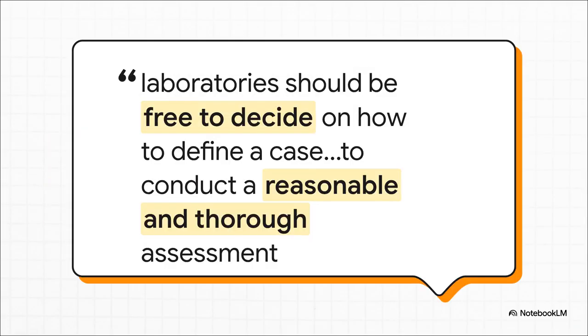You know, one of the most practical things about this guideline is its flexibility. For example, it doesn't give you some rigid definition of what a case is. The panel totally got that you need to balance being thorough with being practical. A lab can decide if a case means one representative slide or all the slides from an accession, just as long as whatever they choose allows for a really thorough assessment of the system.